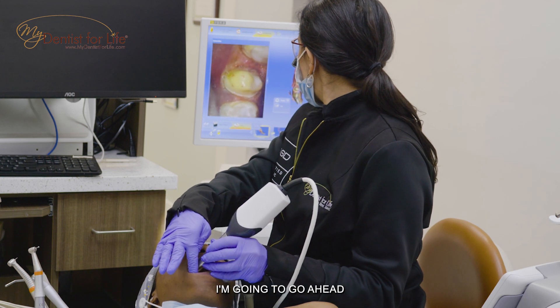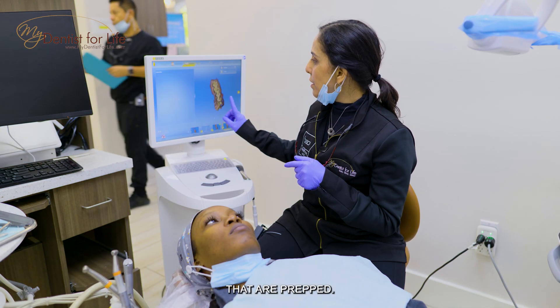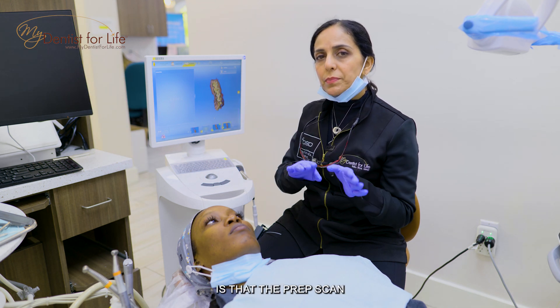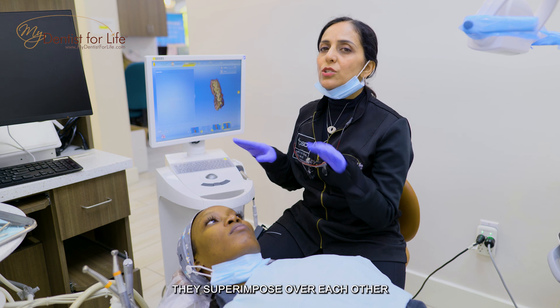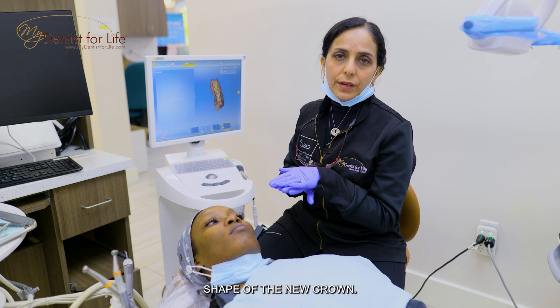Once the teeth are all prepared, I'm gonna go ahead and scan again of the areas that are prepped. The prepped scan and the original scan superimpose over each other and we get an ideal shape of the new crown.